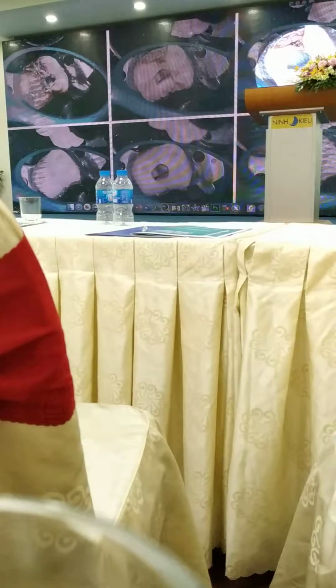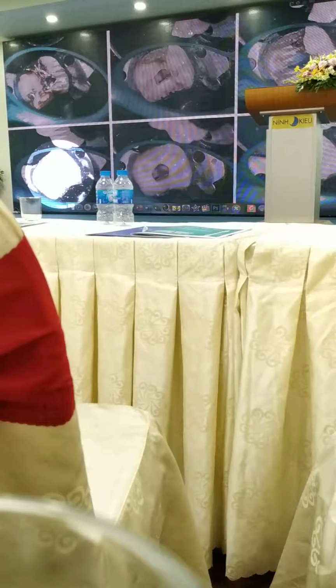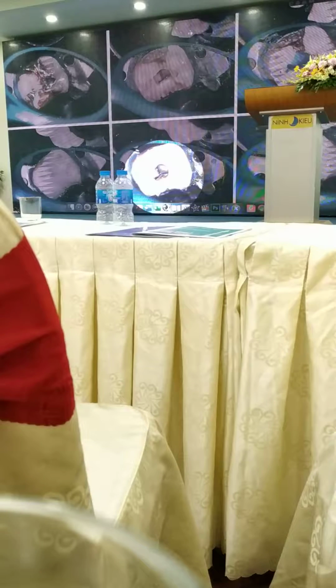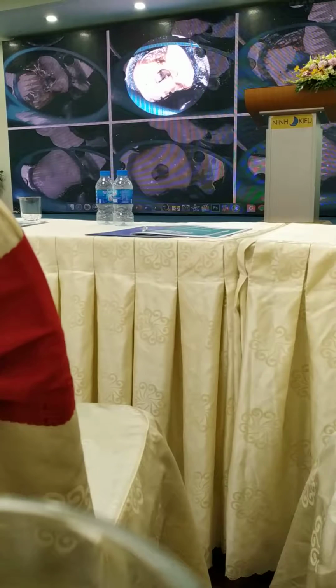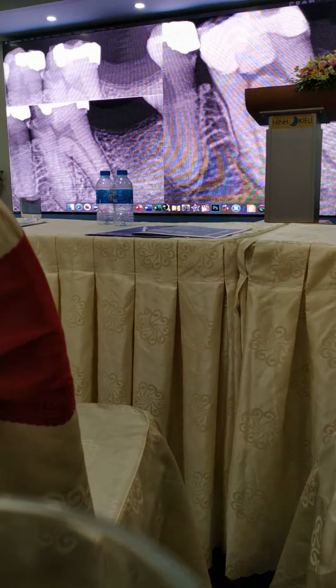I place some Nex Stem LC for protecting my pulp chamber and for proceeding with my pre-endodontic core build-up. And this is my access opening, it is really small because I didn't want to touch this dentinal tissue. I want to keep it.